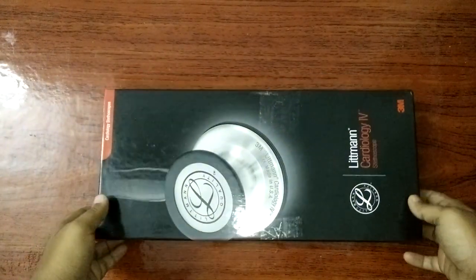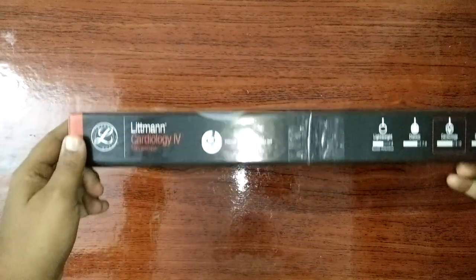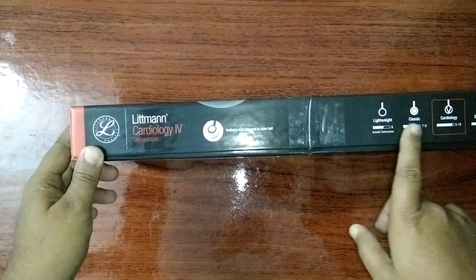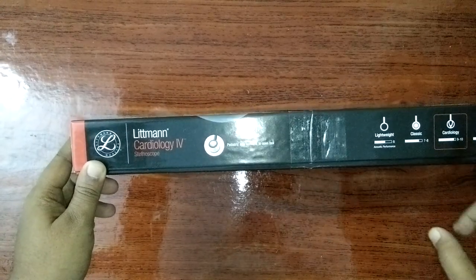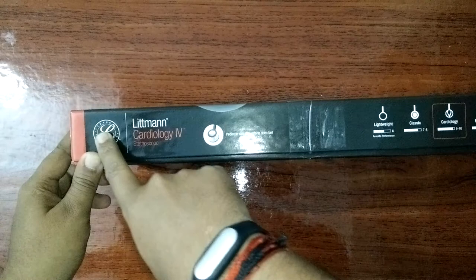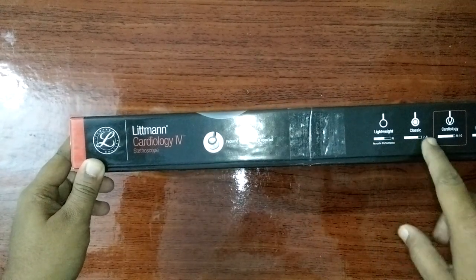Hi YouTube, this is the Littmann Cardiology stethoscope from 3M. I bought this from Amazon.com for my sister. As you can see, this is the brand thing, the logo, lightweight and some performance.